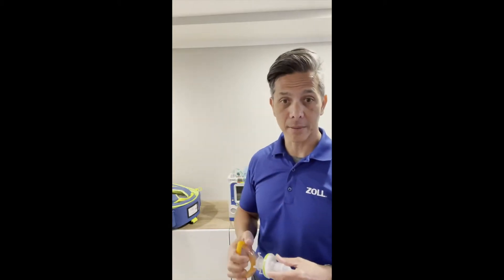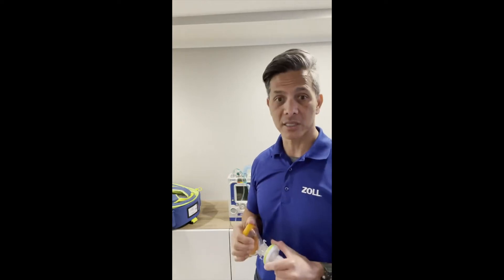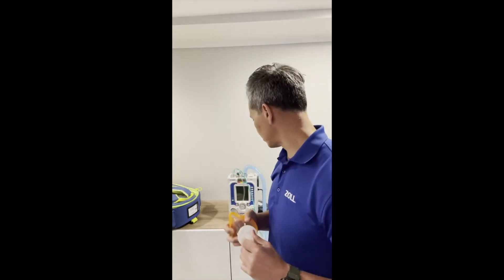Because we're short on time, I didn't get a chance to cover everything — this vent also has inverse ratios and many more functions. I hope you liked this product demonstration. My name is Tito. Thank you.